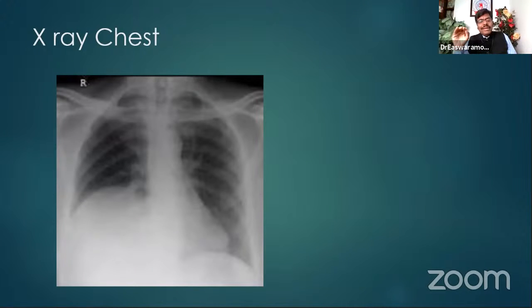But there are a lot more things you can learn from the X-ray chest. The X-ray chest is not only for physicians. Surgeons, we do X-ray chest for various reasons. One, as a pre-operative investigation to look at the patient's pulmonary status before submitting them for anesthesia. That's a common reason we do X-ray. Second, there are some intra-abdominal conditions that can cause some findings in the X-ray. In the last class on trauma, I said when a patient comes with abdominal trauma, he can have an associated chest trauma also, like wide mediastinum, ruptured diaphragm, fractured ribs, flail chest.